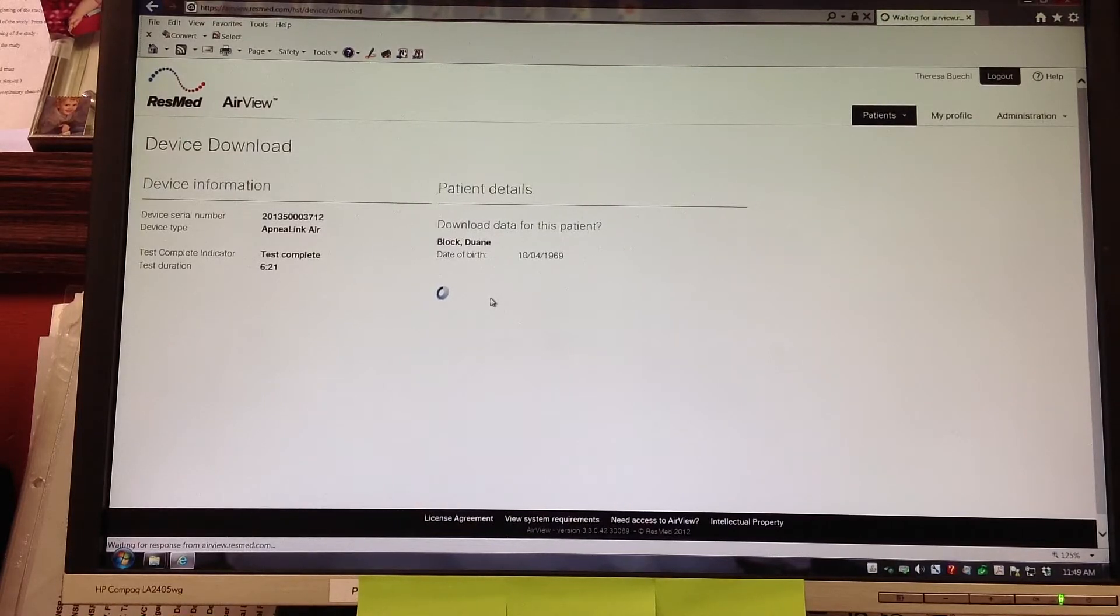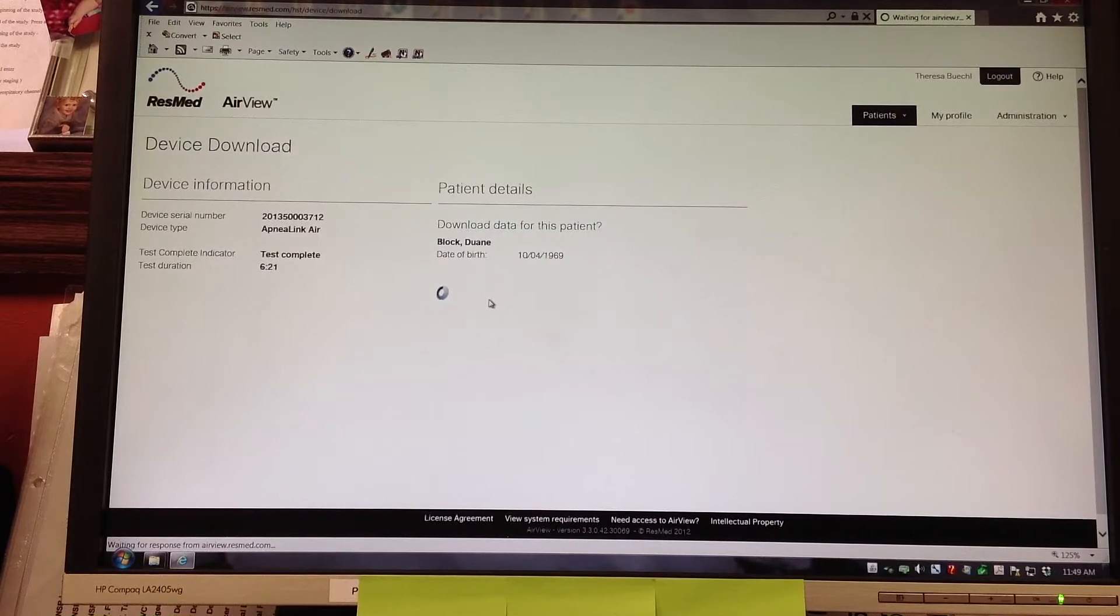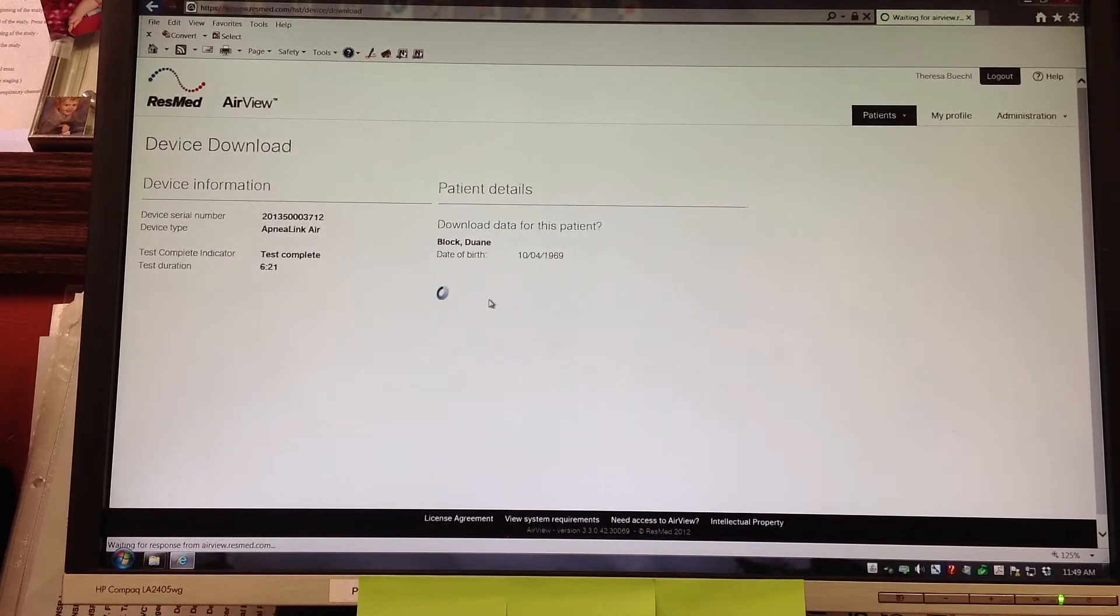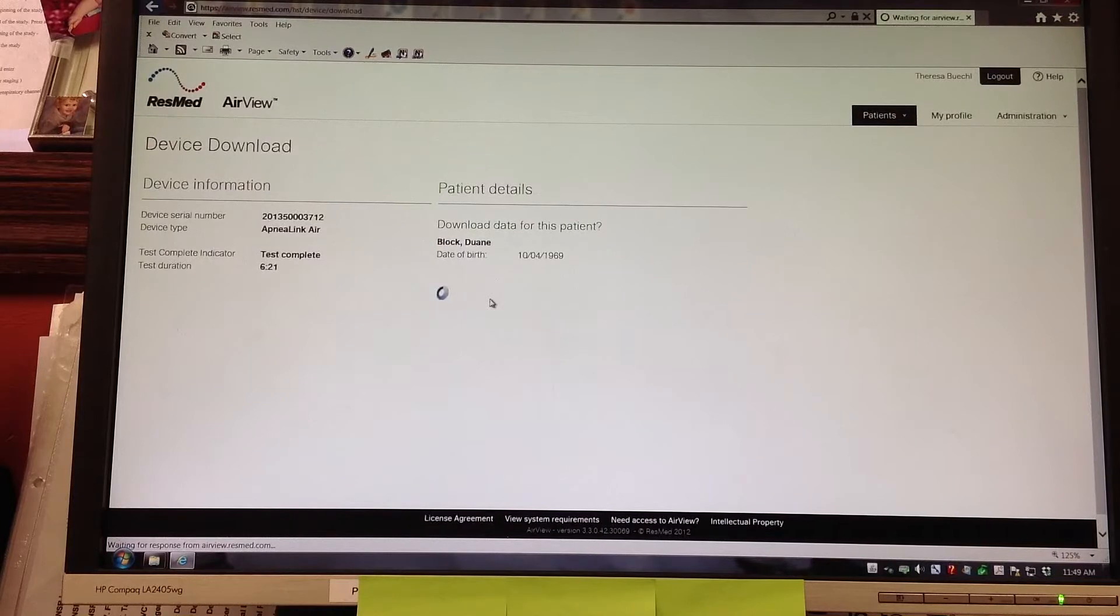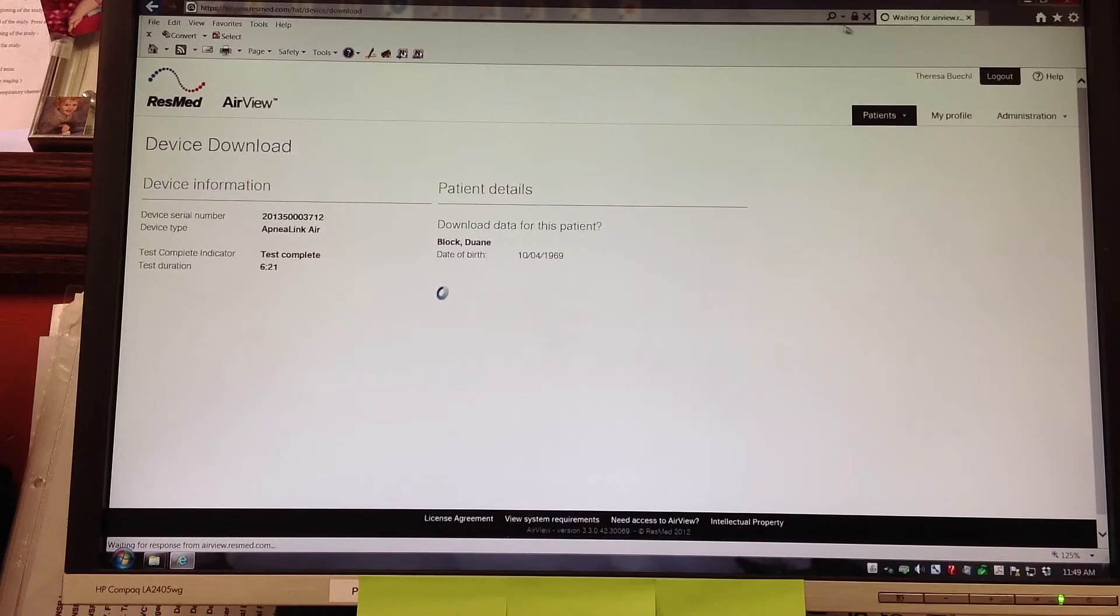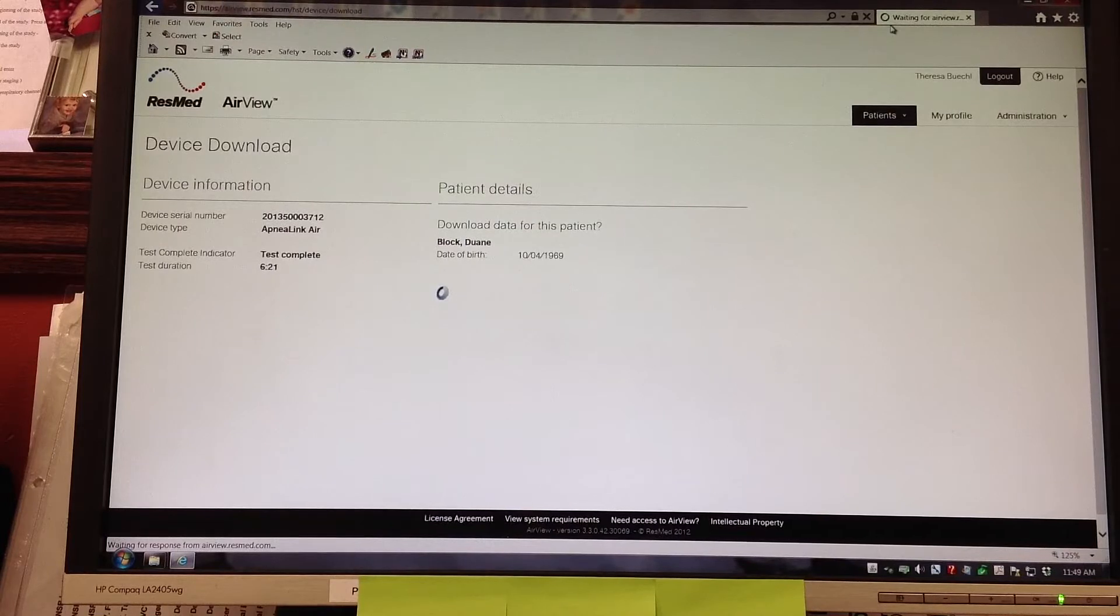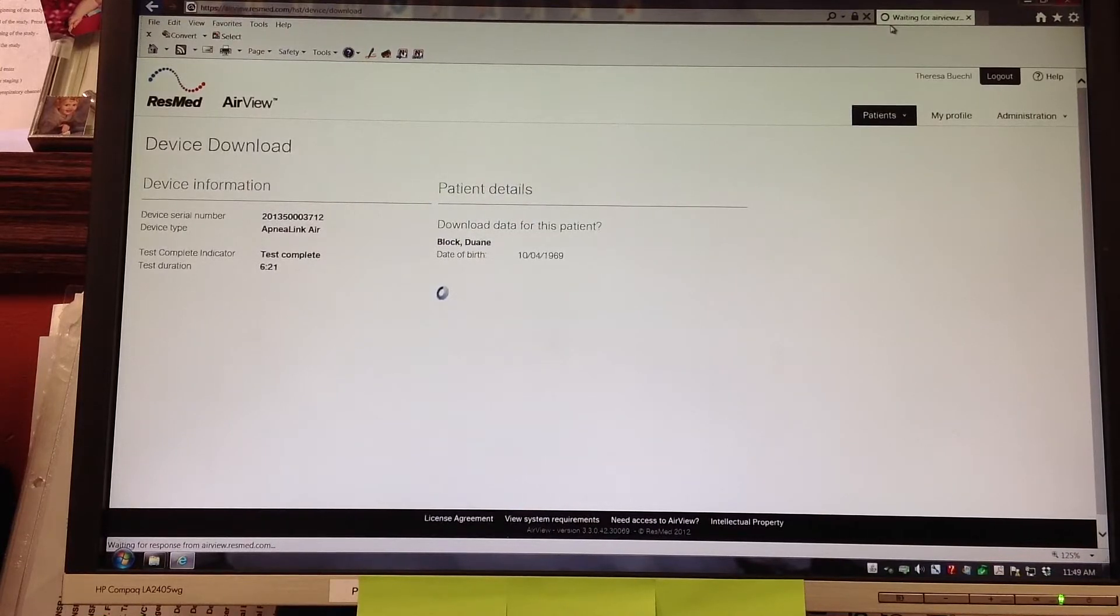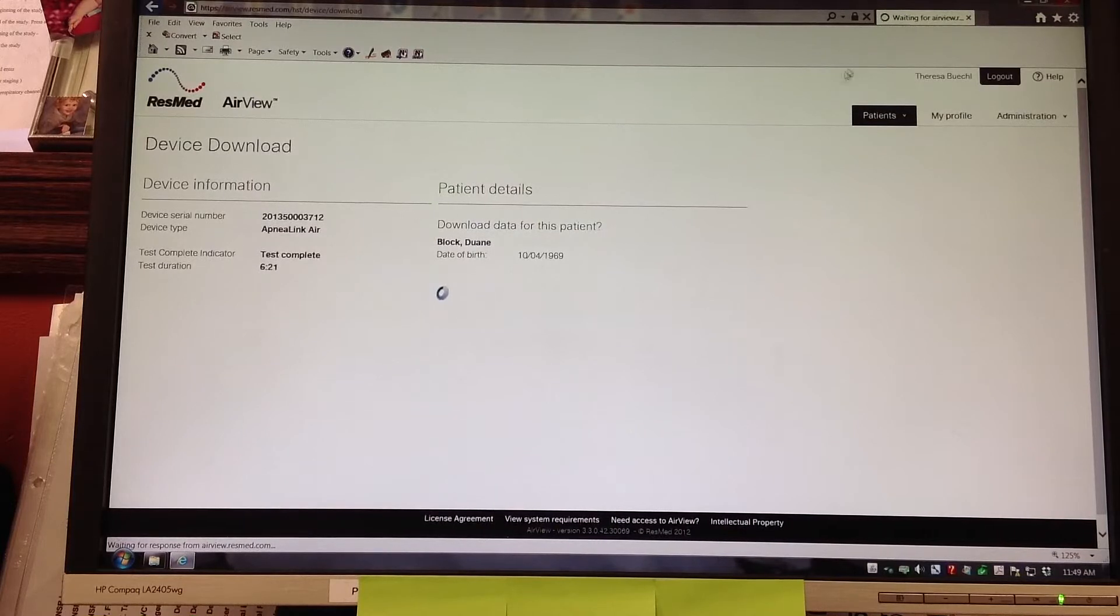On the screen it also shows the serial number of the device, that the test was completed and the duration time of the test. You can see that the test was completed and the test duration is 6 hours and 21 minutes. It is waiting for the data to be downloaded and that is what we are looking at on the screen right now.